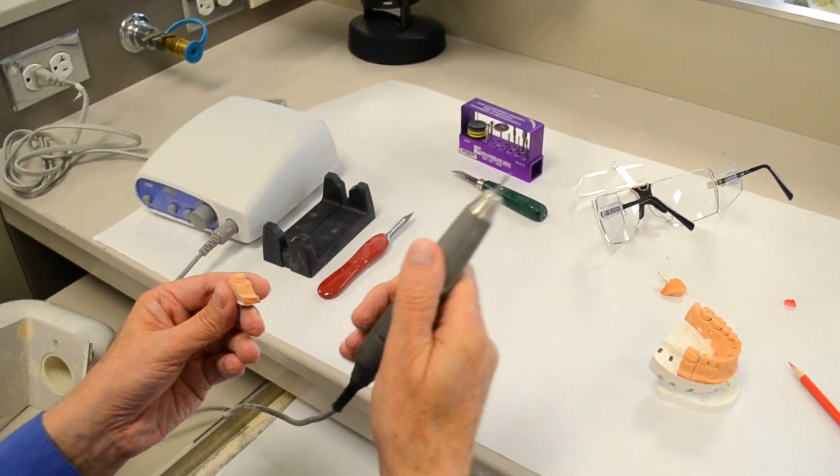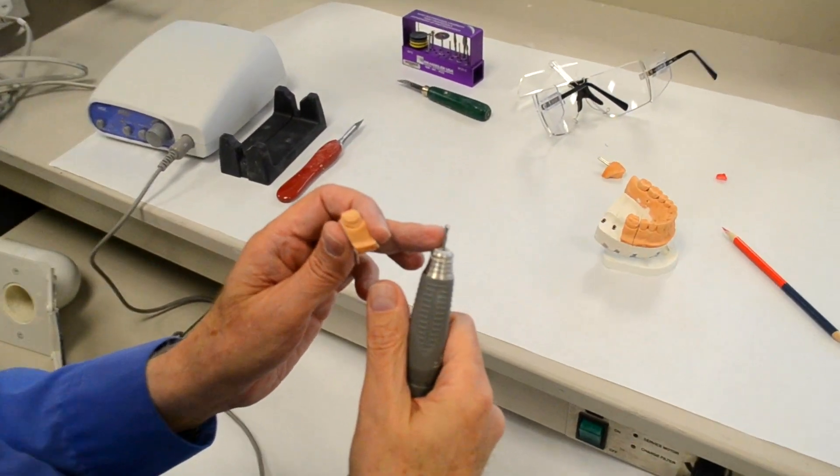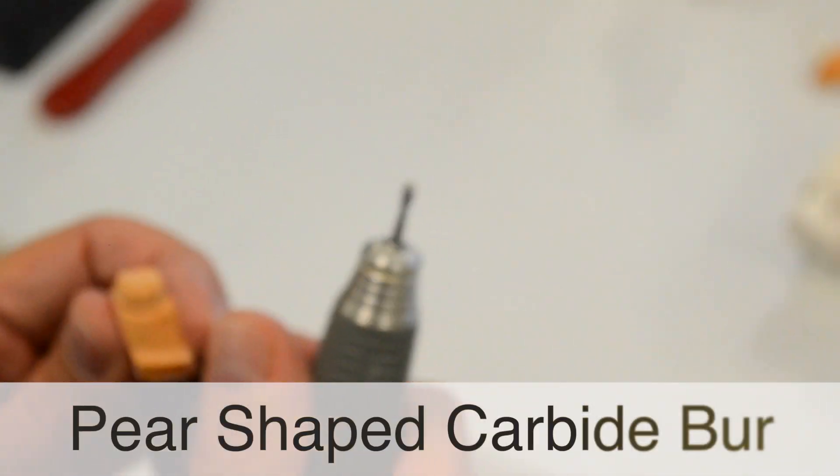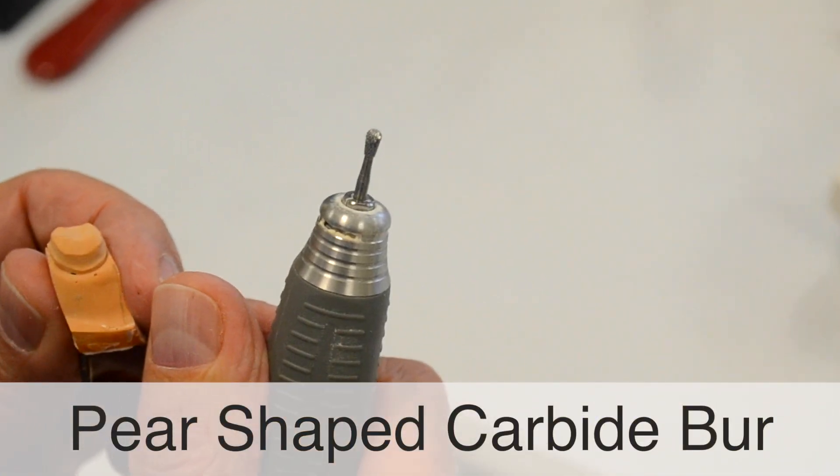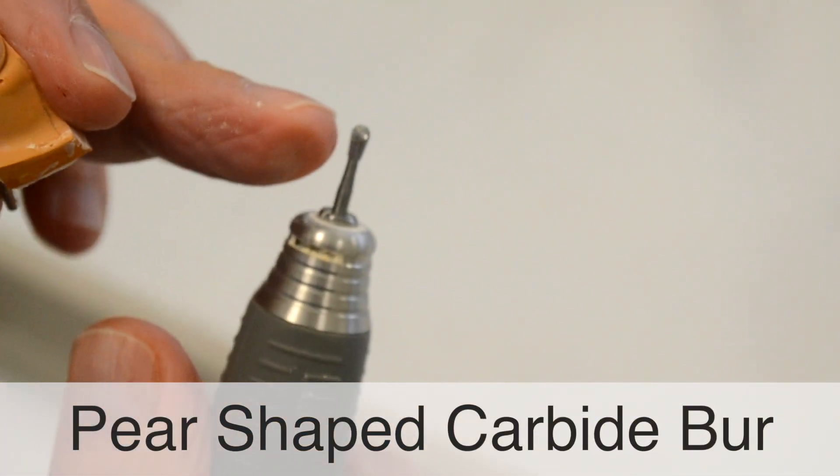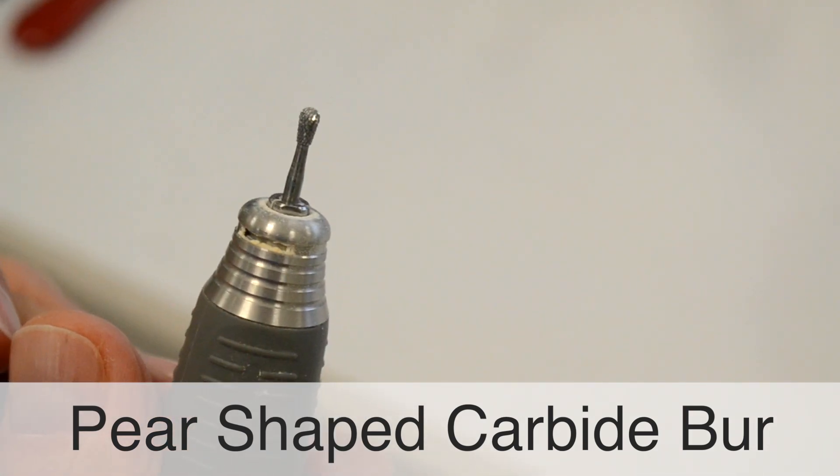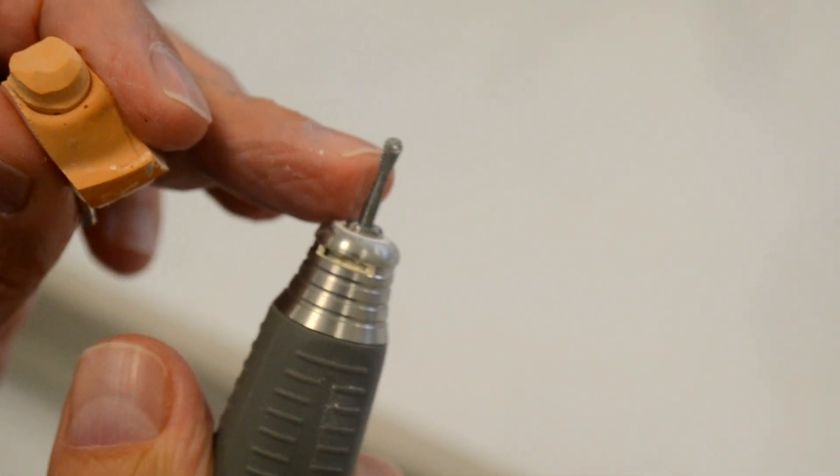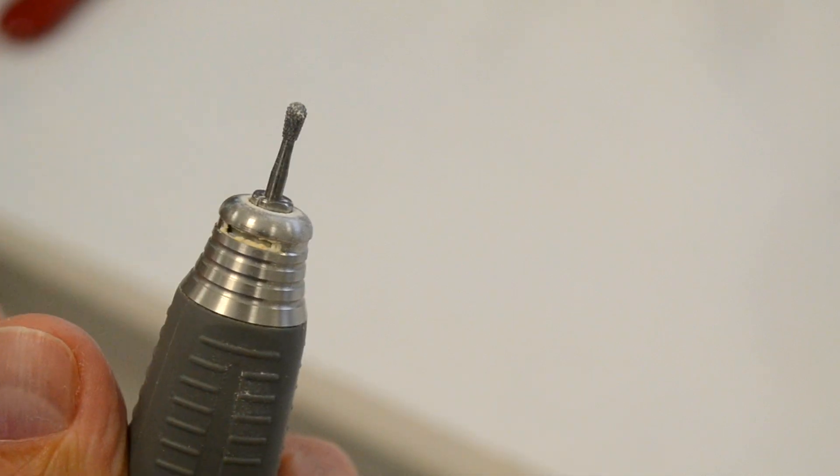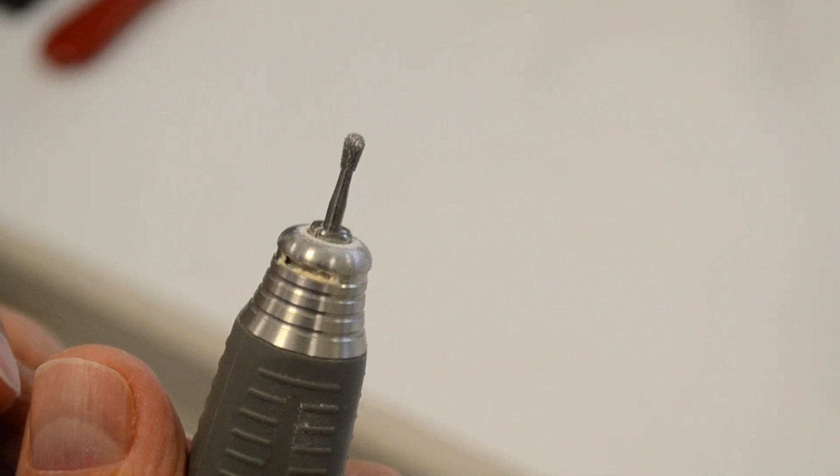The instrument that I like to use for die trimming is the pear-shaped slow speed burr. It's a carbide laboratory burr. It has a cutting edge on the tip that is approximately two and a half millimeters in diameter. The cutting edge along the side of the burr is approximately five millimeters in length. So it's the ideal burr for die trimming.